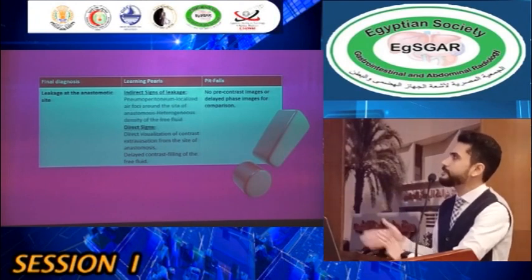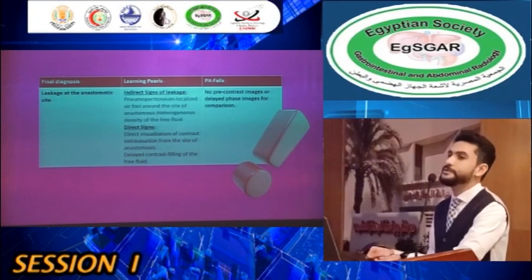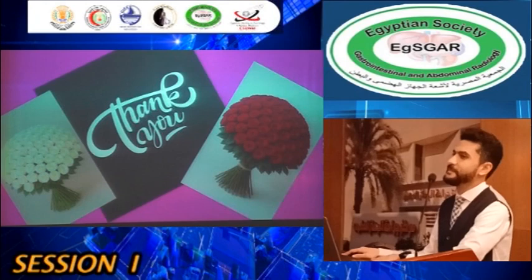I'll talk about the pitfalls here. If you have a non-contrast image, you can compare it with the post-contrast image. However, if you do a post-contrast CT at portovenous phase, you should have a delayed phase to compare both phases to see that there is increased attenuation of fluid and to diagnose the post-operative leakage. Thank you.